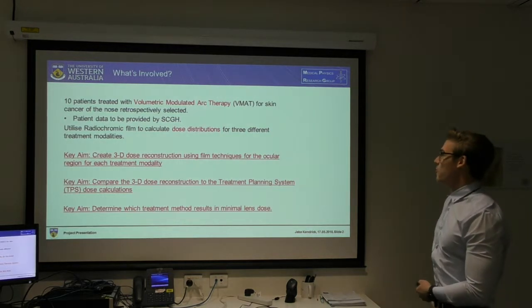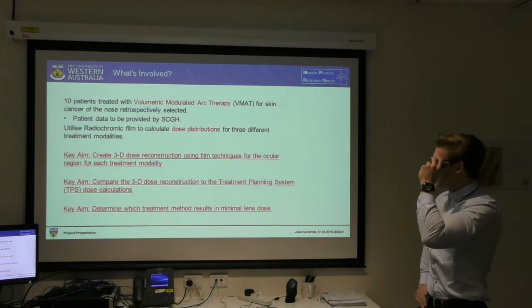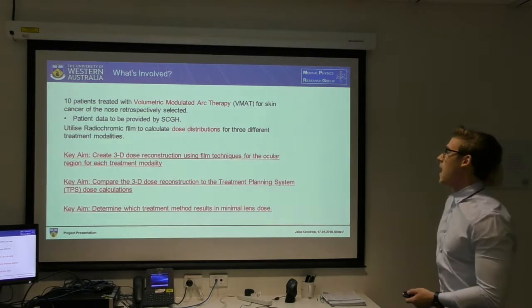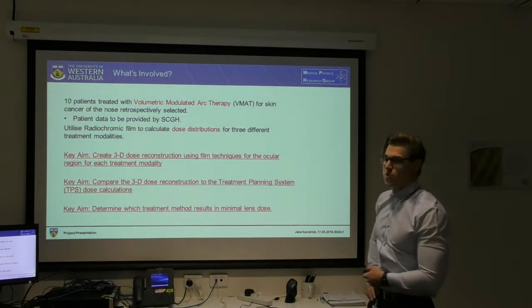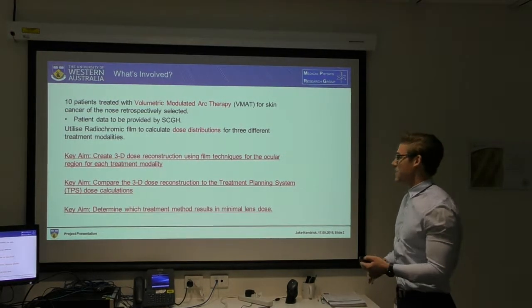Okay, so what's involved in this project basically? Well, 10 patients already treated with volumetric modulated arc therapy for skin cancer of the nose will be retrospectively selected. The patient data will be provided by Charlie's, and my aim will be to utilise radiochromic film to calculate dose distributions for 3 different treatment modalities. And basically this leads into the 3 key aims of this project.